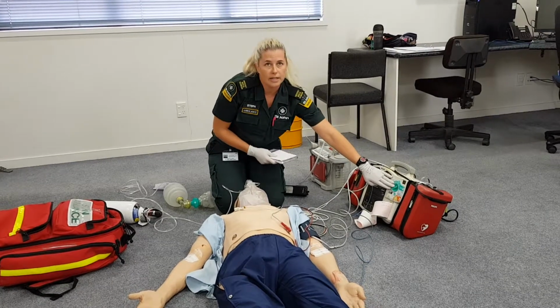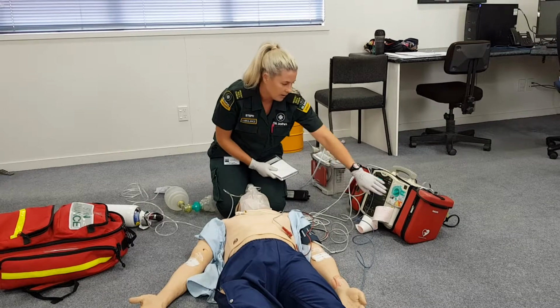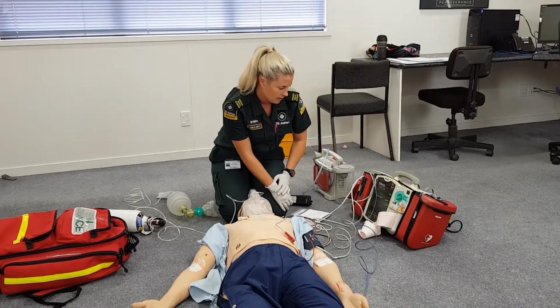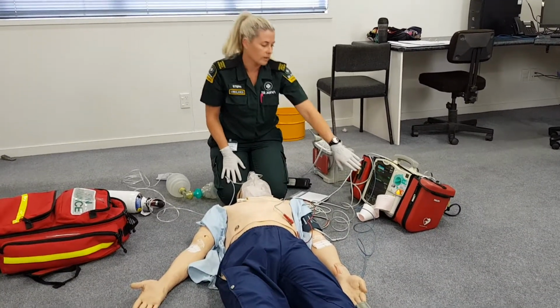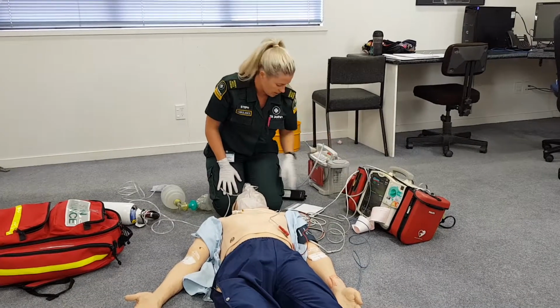Okay, and we're on max joules, and we're going to go ahead and do our shot. So we're going to charge and make sure everyone's clear before we do anything. Yep, everyone's clear. Shocking now, and we're going to push and hold until the shock is delivered.